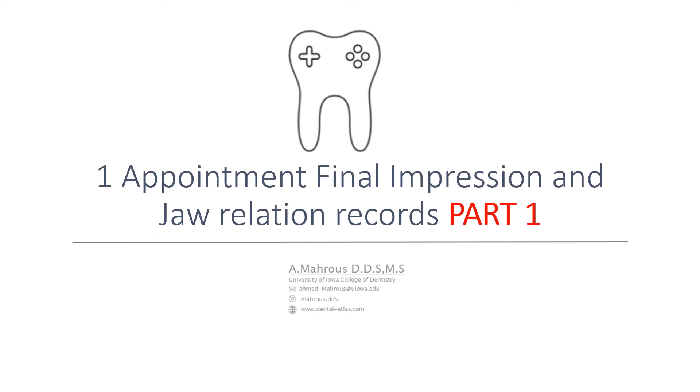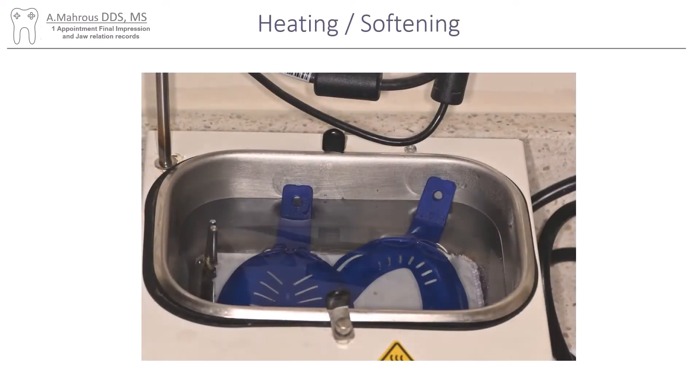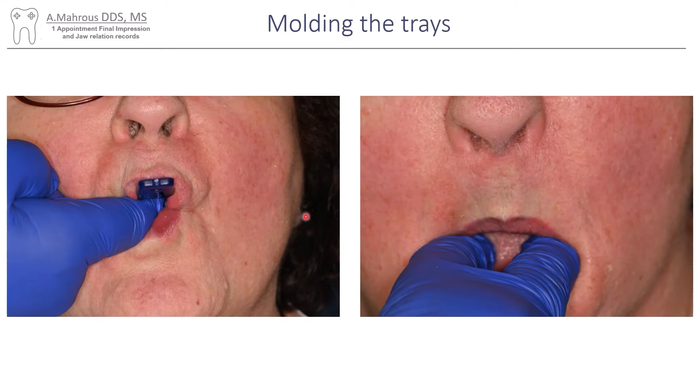I start off with these thermoplastic trays — these trays are from Evident, but I'm sure there are other trays on the market that do the same thing. You put those trays into a hot water bath like this one and that gets them nice and soft. Then I take those to the patient's mouth and you really want the patient to move their tissues to mold those trays — you want to almost create a custom tray from that stock thermoplastic tray. You can see I'm really having the patient move their lips forward almost into a pucker on both the maxillary and mandibular arches.